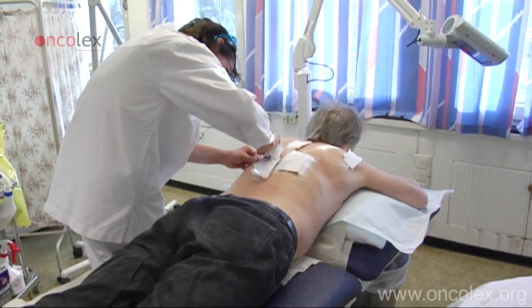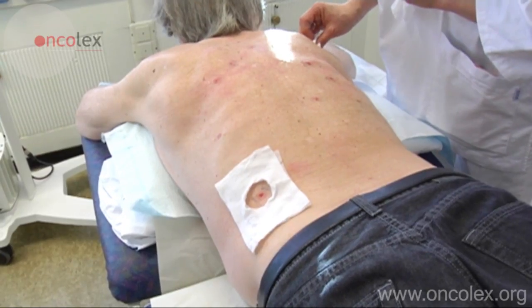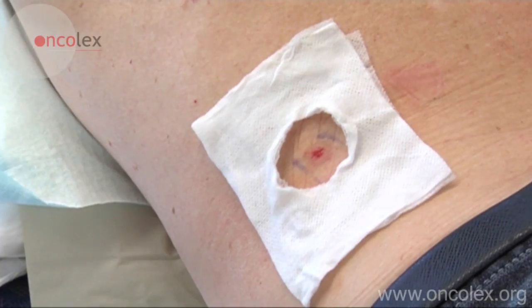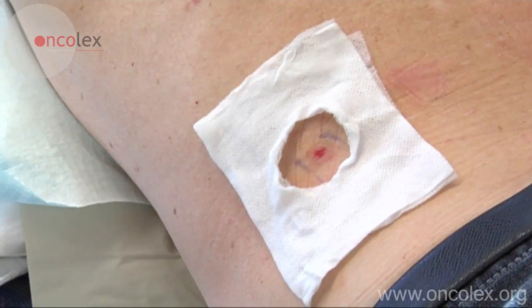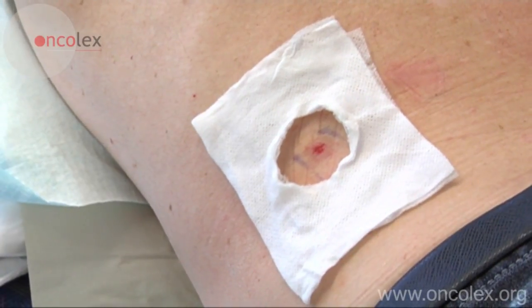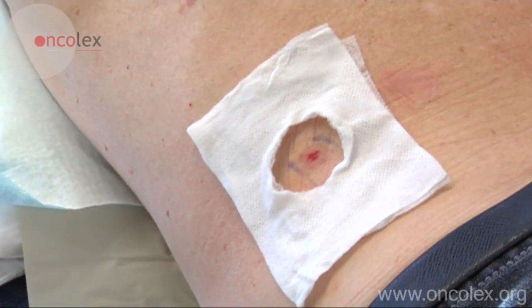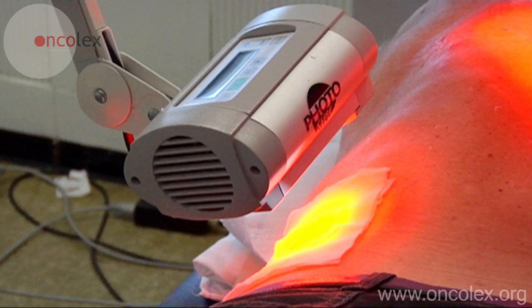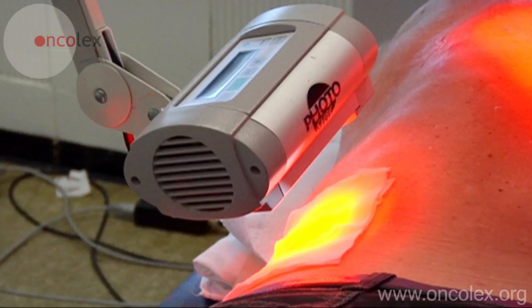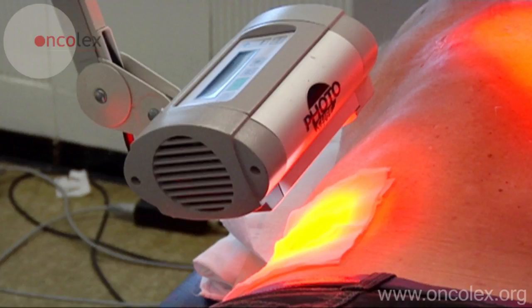After 3 hours, the lesion is ready to be exposed to the red light. A sponge is placed around the lesion to reduce the heat exposure of the healthy skin. The lesion is exposed to red light for approximately 8 minutes.